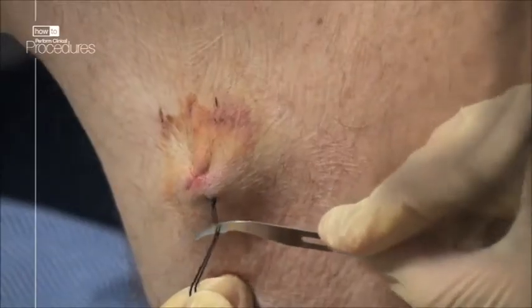To finish, cut the suture to an appropriate length and cover with the simple dressing.